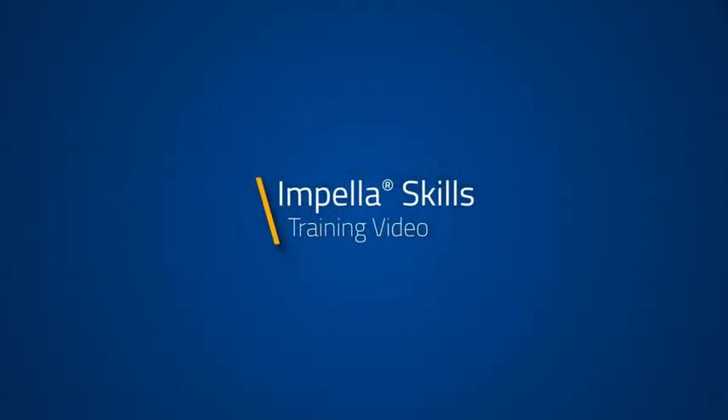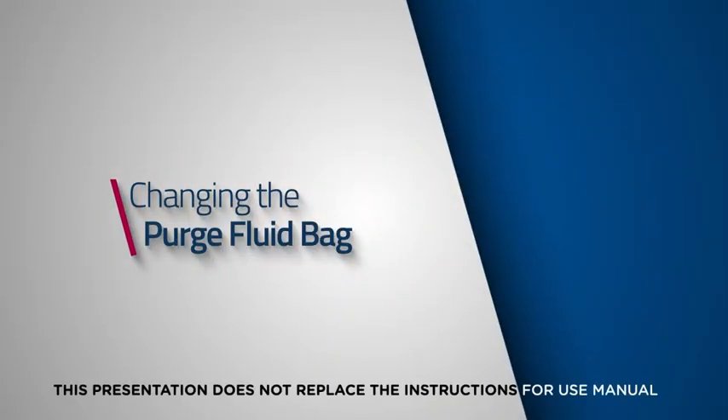This quick skills video is designed to demonstrate how to change the purge fluid bag for the automated Impella controller. This presentation does not replace the instructions for use manual.